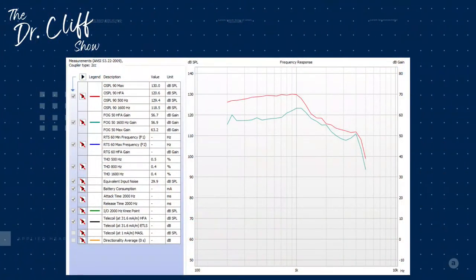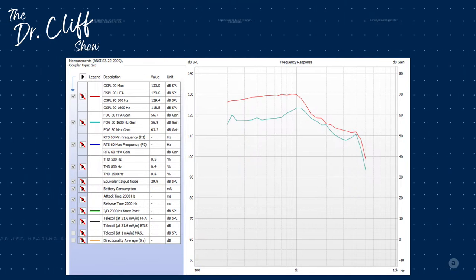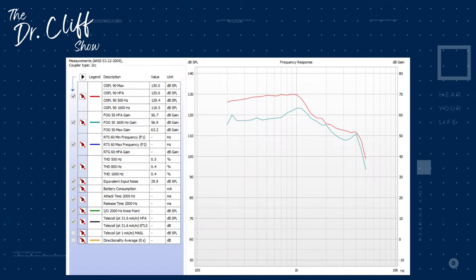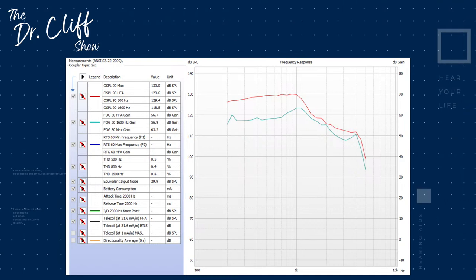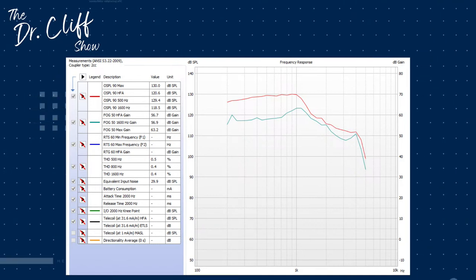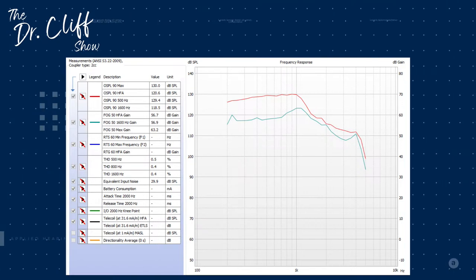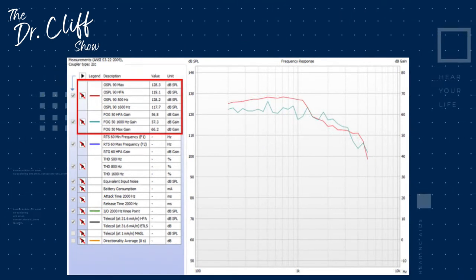And so the very first one that we have to show you is one from a hearing instrument that did pass these specifications. And so if you look over on the left-hand side, that looks crazy, right? There's a lot of really strange names, weird numbers, percentages, uppercase letters, lowercase letters. It looks a little wild. So we are going to contextualize this a little bit further on the failing graphic, but we do have a graphic that outlines in red around the perimeter there, specifically up at the top.